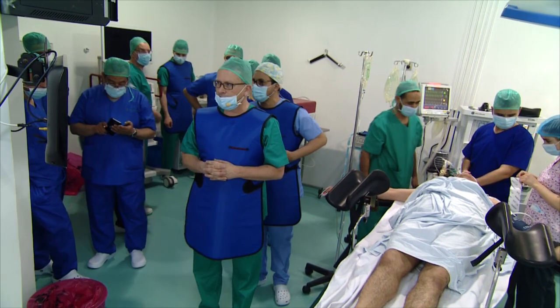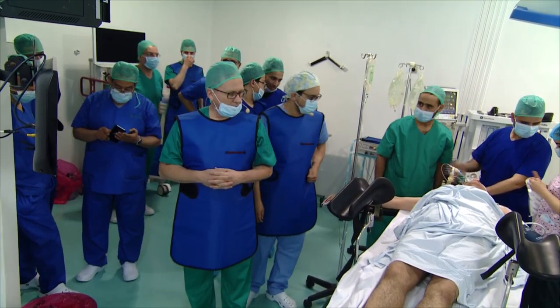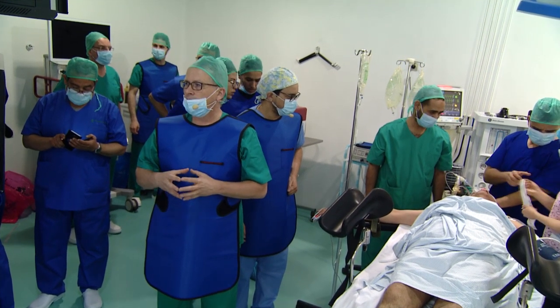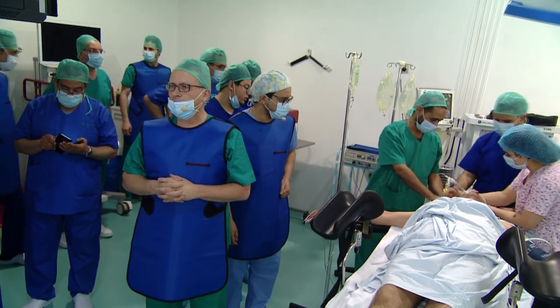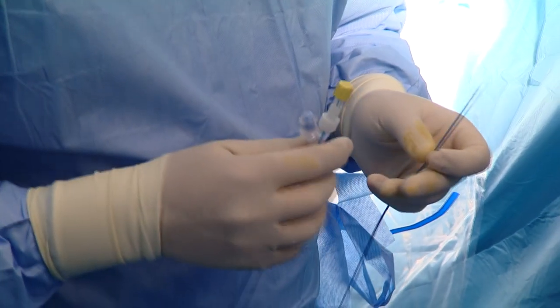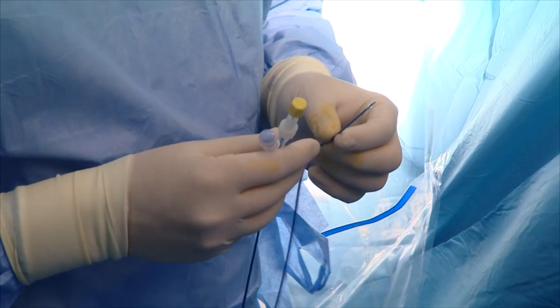It takes a few minutes. We are positioning the patient now, and then I'm going to continue and explain what is our preferred method to perform retrograde pyelography. I just want to explain the particular features of this balloon catheter.